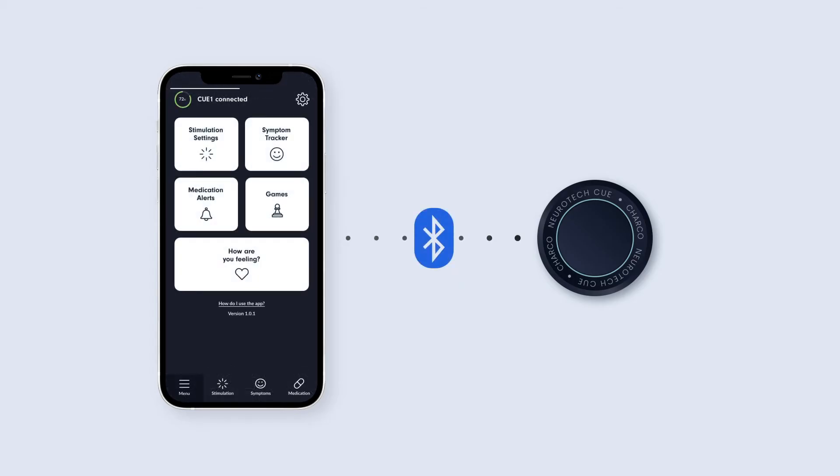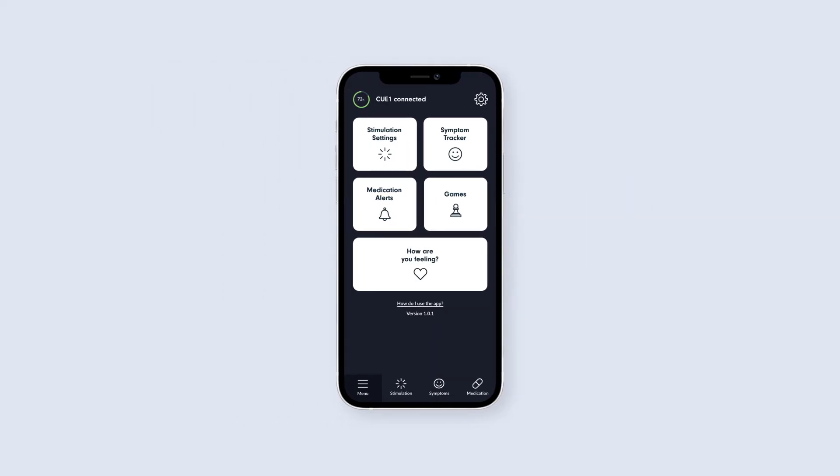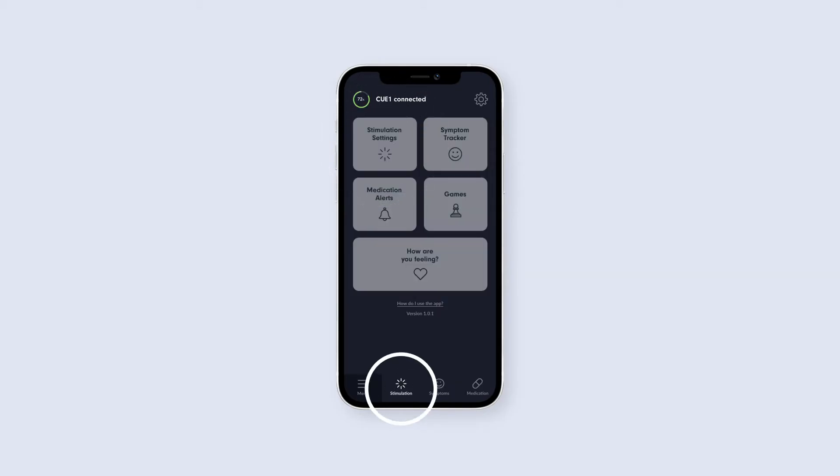Once your Q1 is connected, you will be able to alter the stimulation settings, which you may wish to do to match the Q1 to your personal comfort preferences or potentially improve its efficacy. Access this feature by tapping the Stimulation Settings tile on the home screen, or Stimulation tab at the bottom of the app.